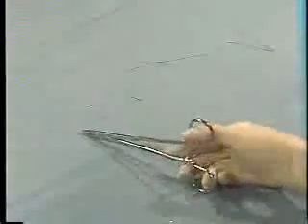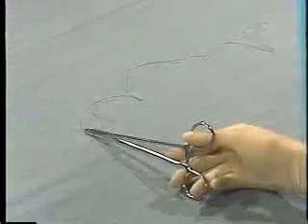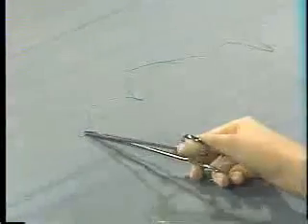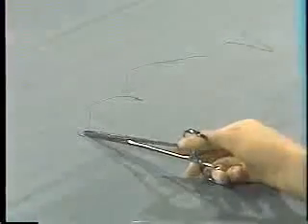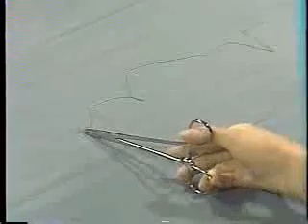Load the needle on the needle holder about halfway along the needle. Some will tell you to load the needle closer to the tip. Others will tell you closer to the back. If you load it in the center, you will probably please everyone. Load the needle with the sharp end pointing up.